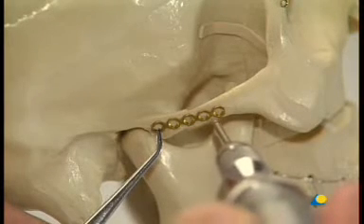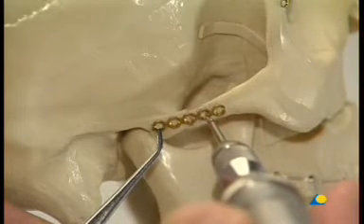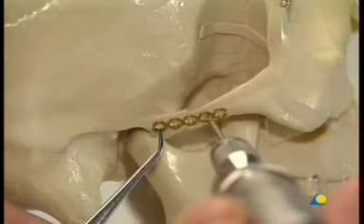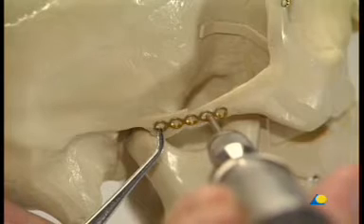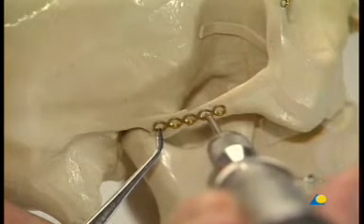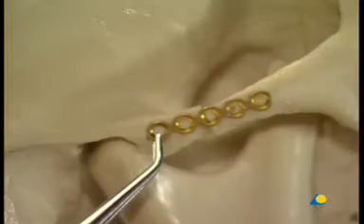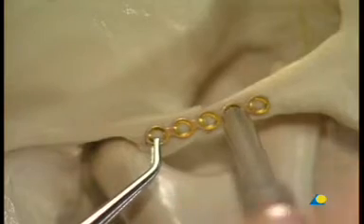The first hole is drilled next to the fracture line in the zygomatic portion with a 1.1 mm drill bit with 6 mm stop. A 6 mm long 1.5 mm screw is inserted.